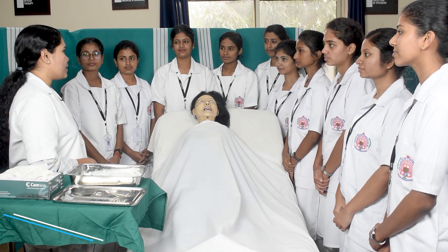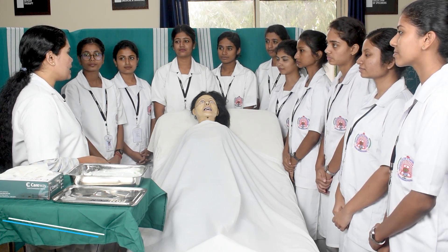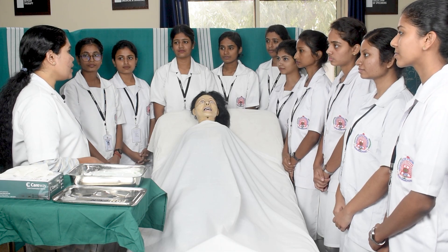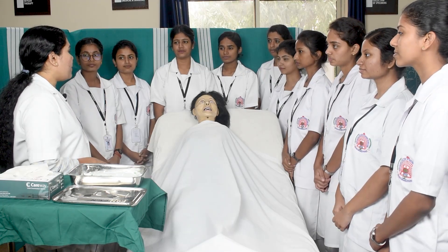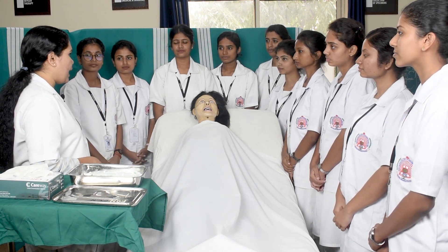Good morning. I am Almas Banu from Sarvodaya College of Nursing. Today in this video we will be seeing how to introduce a nasogastric tube, also popularly known as a ryle's tube. By introducing a ryle's tube we can gain direct access to the stomach and gastric contents.